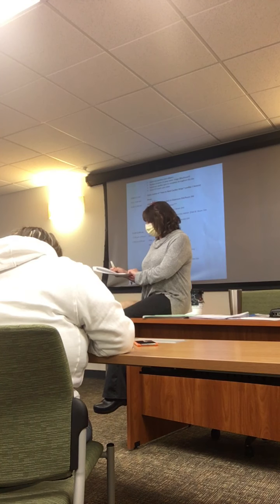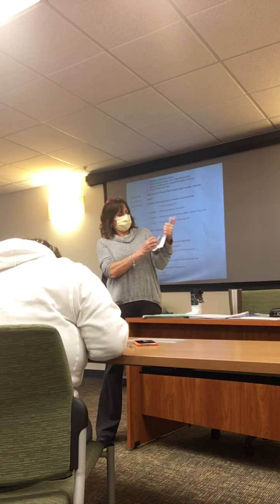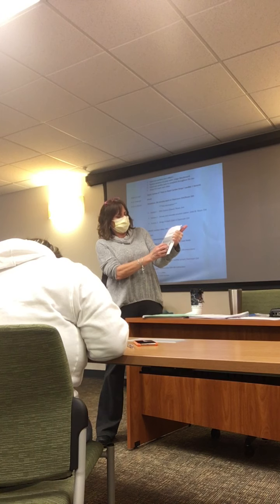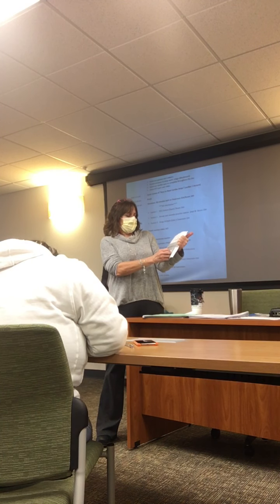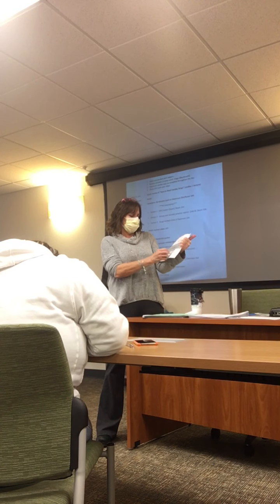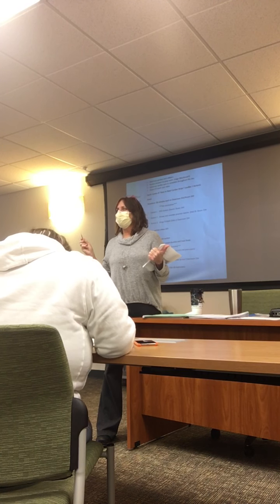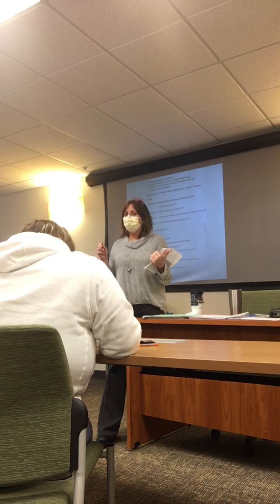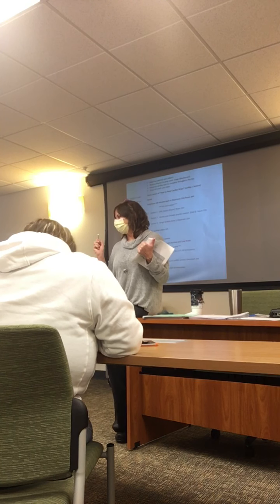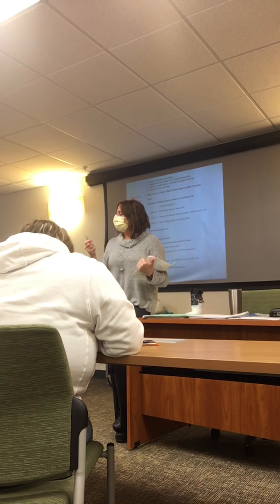Okay. So the next thing I want to do is measure the PR intervals. So I take my calipers, I put them on the beginning of the P wave to the beginning of the QRS complex. I count the number of small boxes in that area, and how many small boxes are you getting? 3. So 0.04 times 3 is 0.12. Is that normal for a PR interval? Yes. What's the normal PR interval? Good. So less than 0.20. Good. So that's normal. So the atria is doing good.